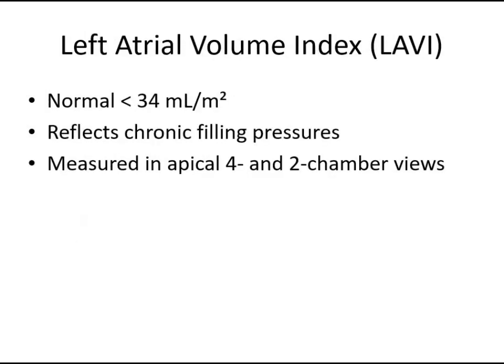Left atrial volume index is the marker of chronic diastolic pressure overload. Normal value is less than 34 milliliters per meter squared. It's measured in the apical 4 and 2 chamber views, and chronic elevation suggests long-standing diastolic dysfunction.